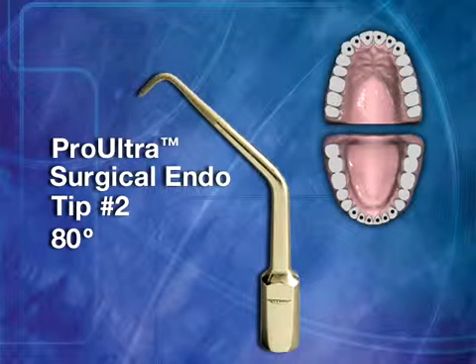Surgical Tip No. 2 also has an 80-degree tip angle. This is a greater diameter version of the Pro-Ultra Surgical Tip No. 1 and is used on canals with larger apical areas.